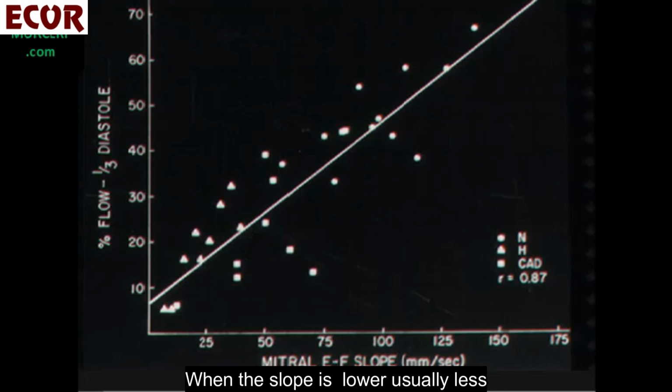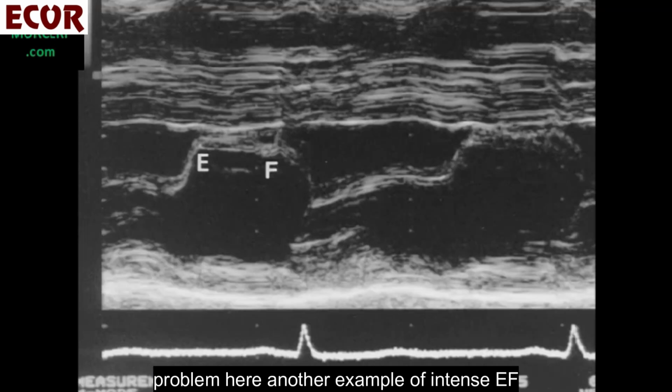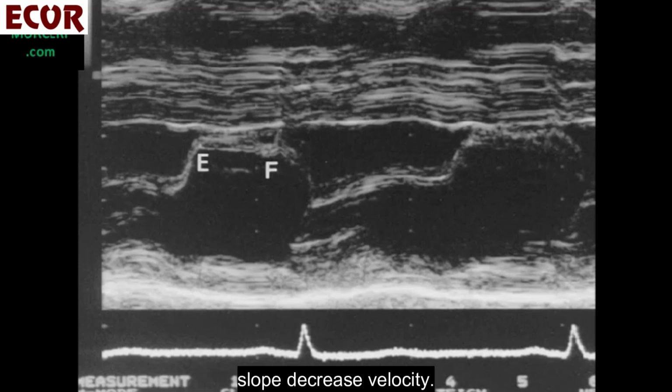When the slope is lower, usually less than 70 millimeters per second, there is a left ventricular relaxation problem. Here, another example of intense EF slope decrease in velocity.